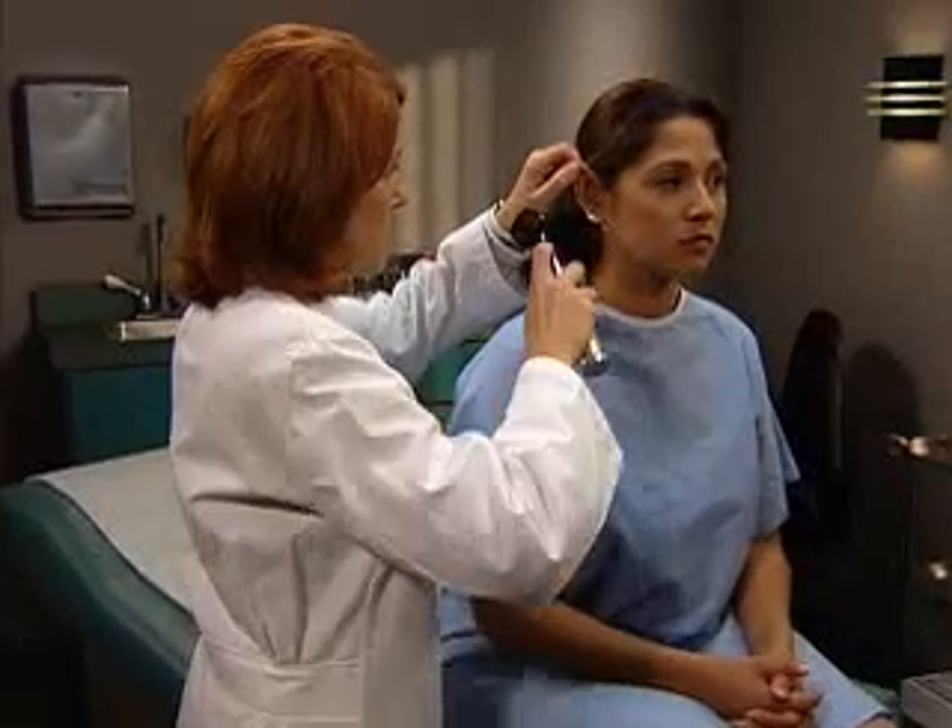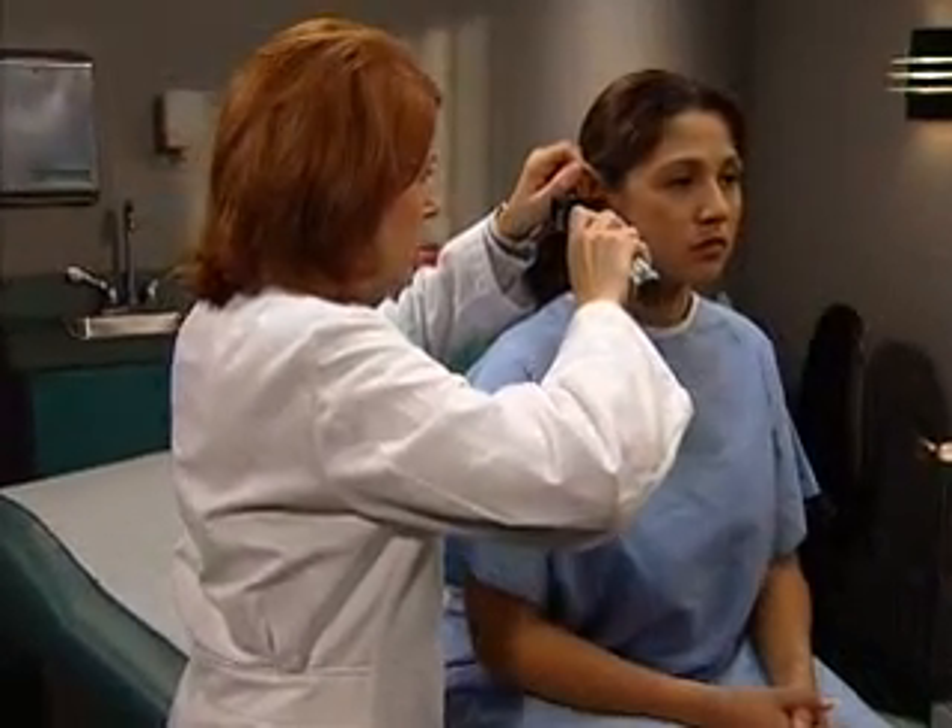If cerumen blocks your view, remove it by irrigation or a cerumen spoon.